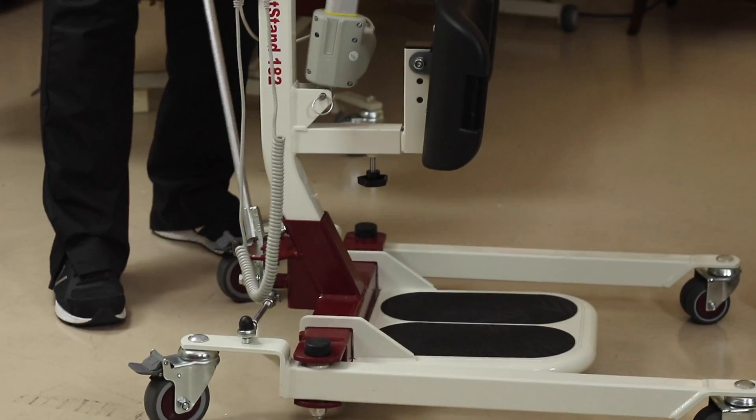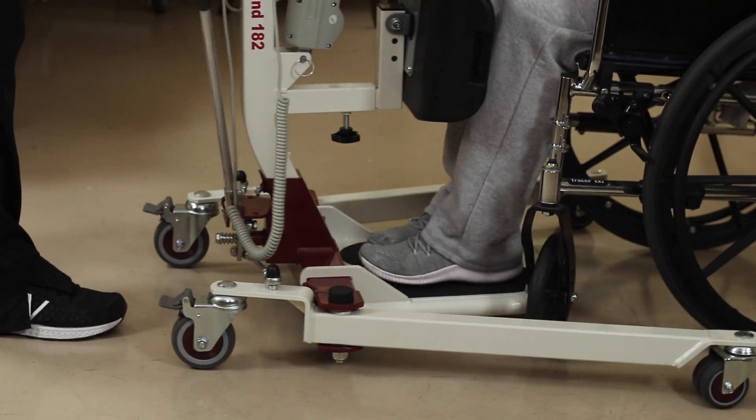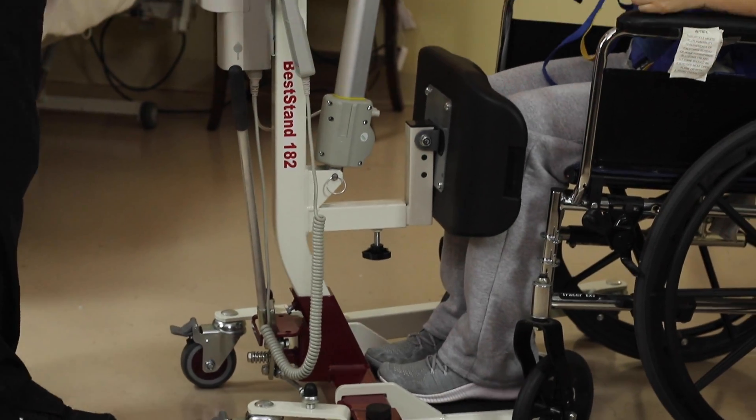Open up the base with the lever that's on the back of the lift. Bring the foot plate and the knee brace up to the patient, bracing against the knees.